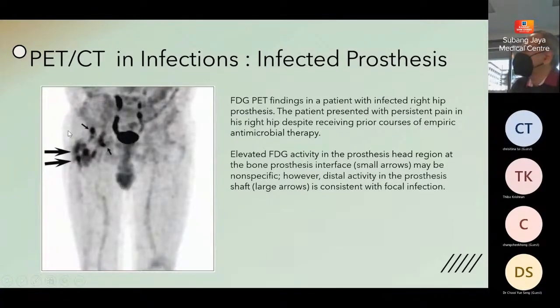Now, hip prosthesis. You can find that a lot of times, several years after the hip prosthesis is in place, patients complain of pain. You're not sure whether it's due to an infected process. You can see the ESR is a bit elevated.